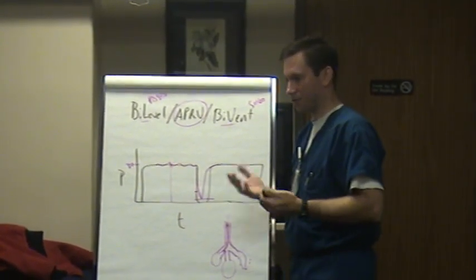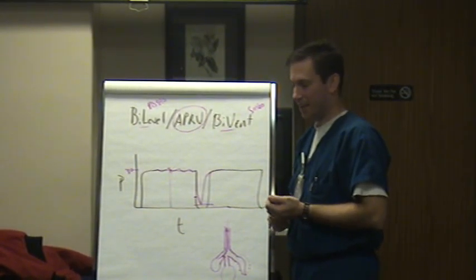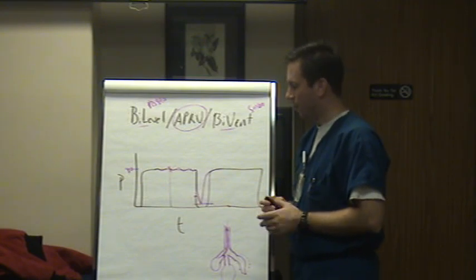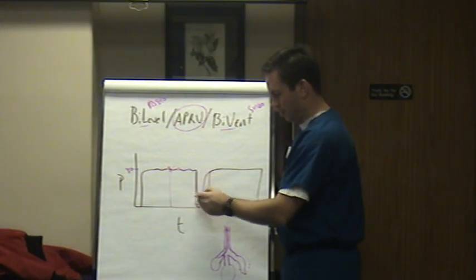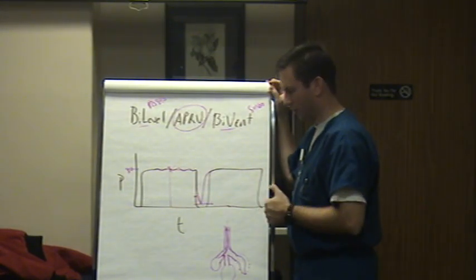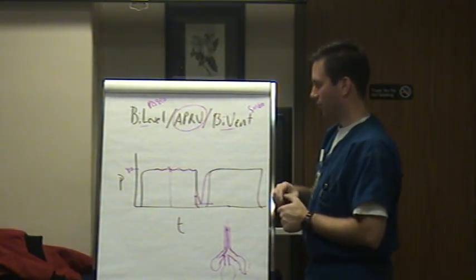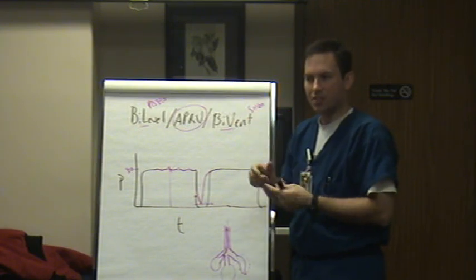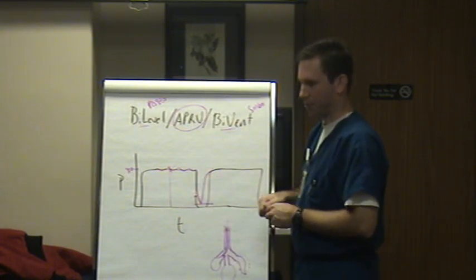What else might they contribute? Cardiac output and venous return. I mean, that's a key. So we can get rid of some of those things that are against us to begin with. And with APRV, though, as Dr. Simpkins manages it, short E time so that you cause some air trapping. Whereas these modes, if we use them typically on 7th floor, we'll allow them to come down, but we're very generous with their low PEEP. So we achieve the same thing, but we just have a known PEEP instead of having a trapped PEEP at that point.